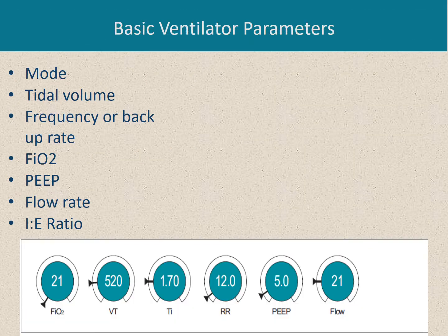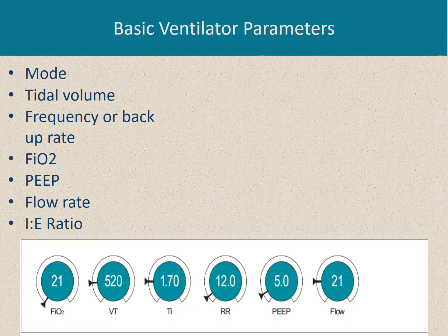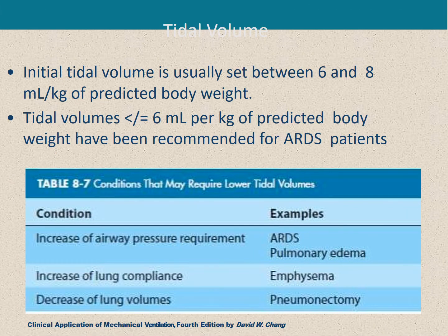After selecting the mode of ventilation, as we have displayed, we will start to set up the ventilator and adjust the knobs of the ventilator. We'll set the tidal volume, respiratory rate, FiO2, PEEP, flow rate, and I:E ratio.